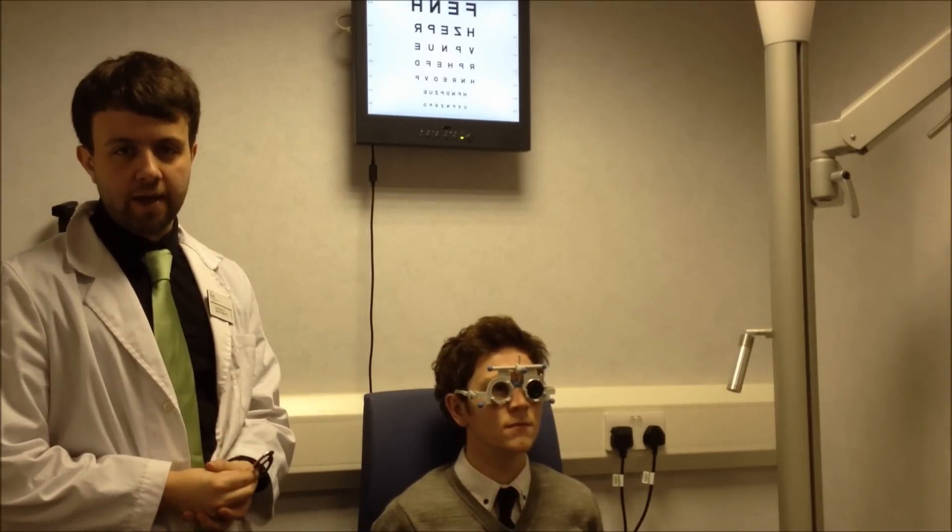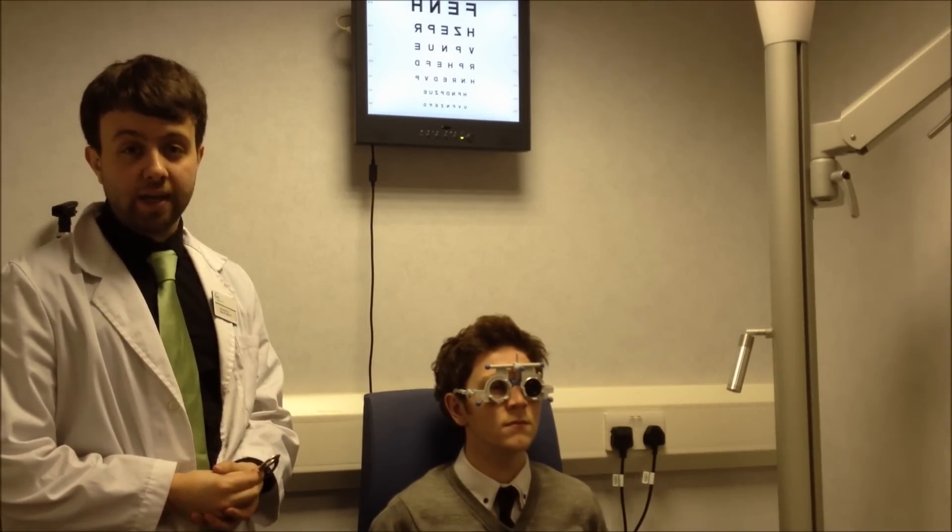How does that feel, Sean? That's great, thank you. Nice and comfortable? Good, excellent. So now that the lens is settled in the eye, we're just going to check that the prescription is accurate.